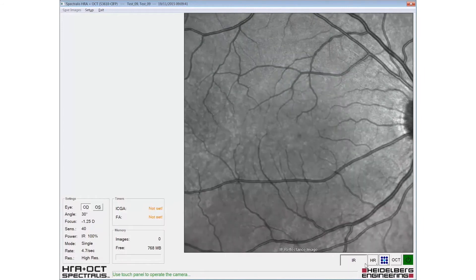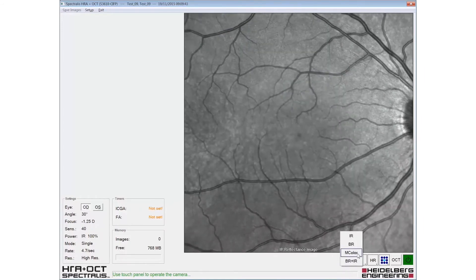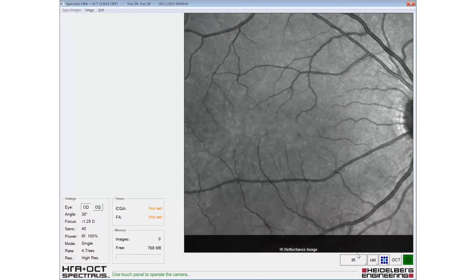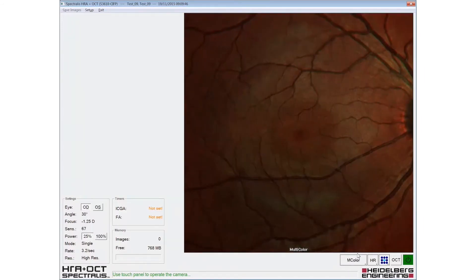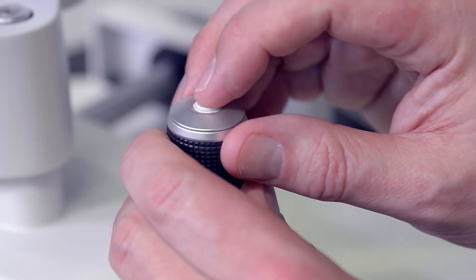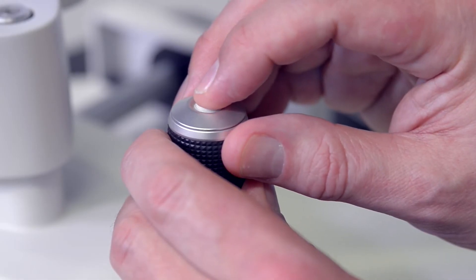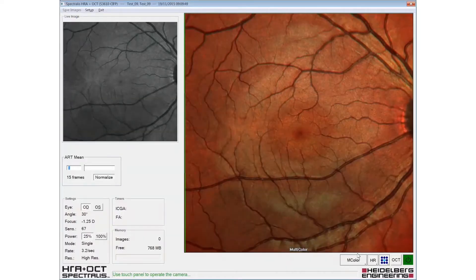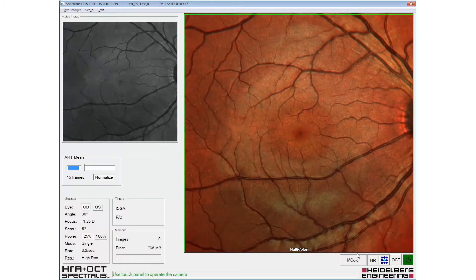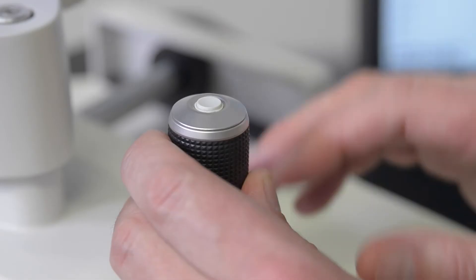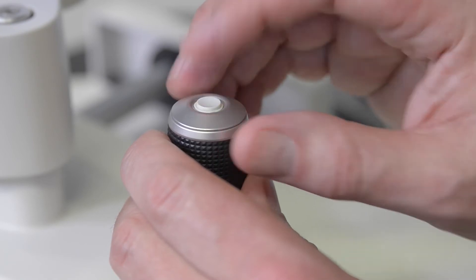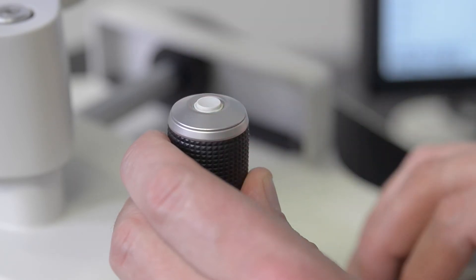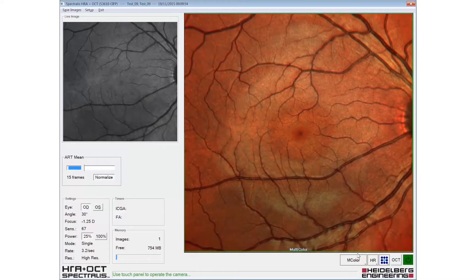The multicolour modality is selected from the pop-up menu. Eye tracking and automatic real-time are engaged with a long press of the joystick button, and an image is acquired with a short button press once the desired number of frames has been reached.